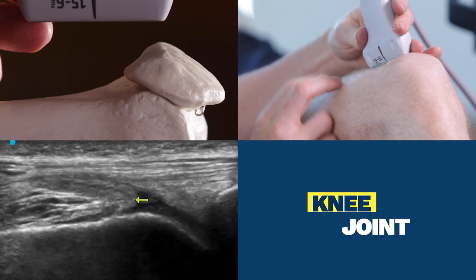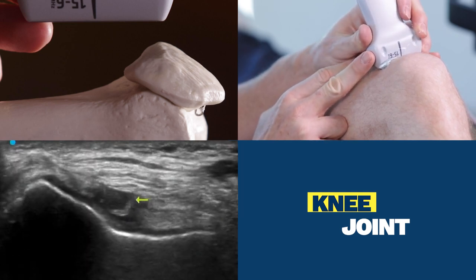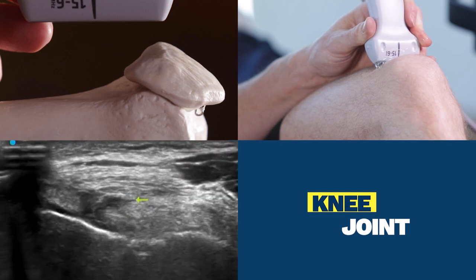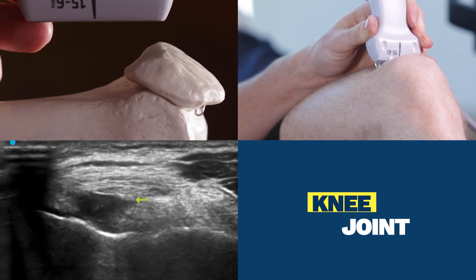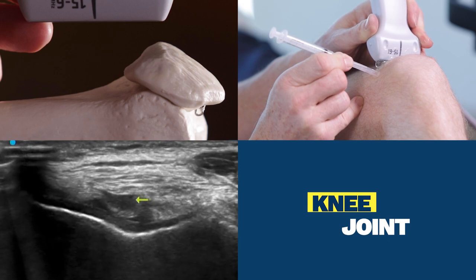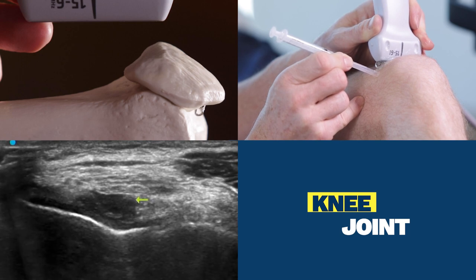To perform the injection, I'm going to spin the probe 90 degrees towards me, and I can see that hypoechoic area there. I need to toe in the probe just enough to be able to get my needle tip up and over the femoral condyle. My needle enters the skin just here and goes to touch the tip of the yellow arrow, like so.